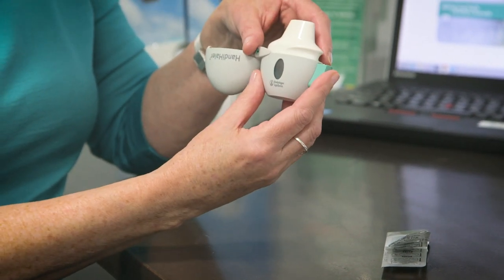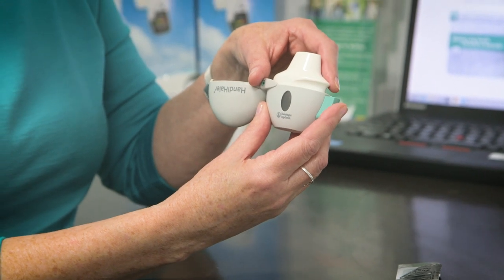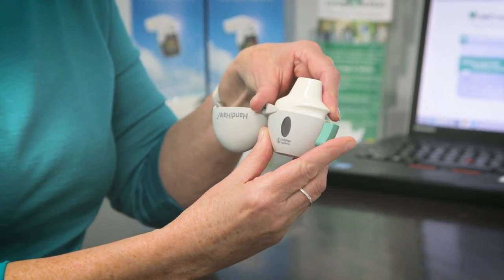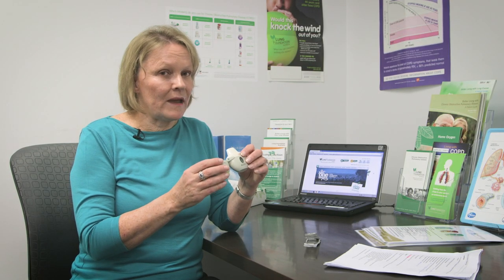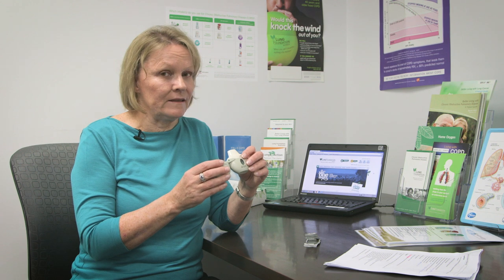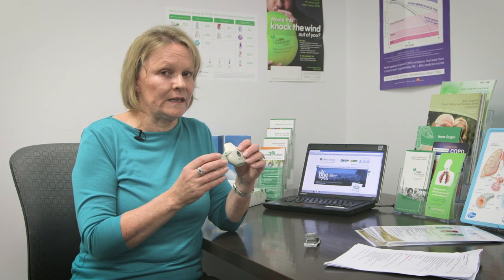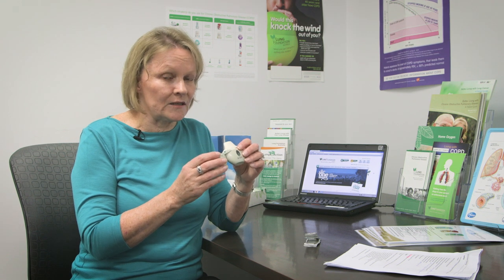You then pierce the capsule with the green button — you only need to do this once. Breathe out away from the mouthpiece. Put the mouthpiece between your teeth without biting, and then seal your lips to form a good seal. You then breathe in slowly and deeply.